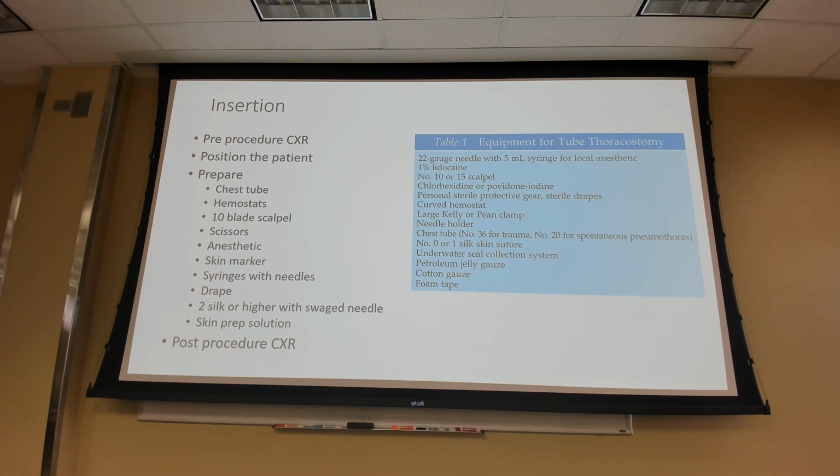So in the hospital, we sterilize the entire kit that's listed here together. Unfortunately, in your roll ones and your medical equipment sets, they have pre-made chest tube kits. They're really expensive, so sometimes you may or may not have those, and everything is packaged together. However, they do issue the units a bunch of unsterilized equipment so you can make your own kits. So you do have to think about where you can get this autoclaved and sterilized if we're concerned about doing chest tubes. Hopefully you can get chest tube kits, but if not, you need to think about all these considerations of what goes into that kit, and you may have to make it yourself, unfortunately.